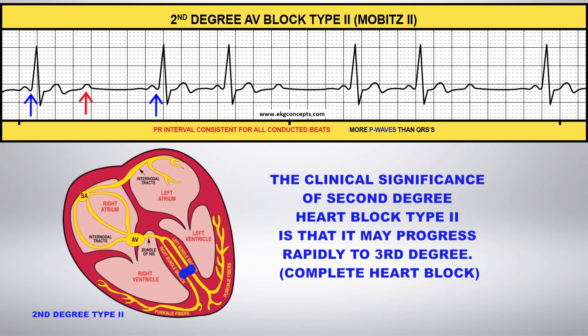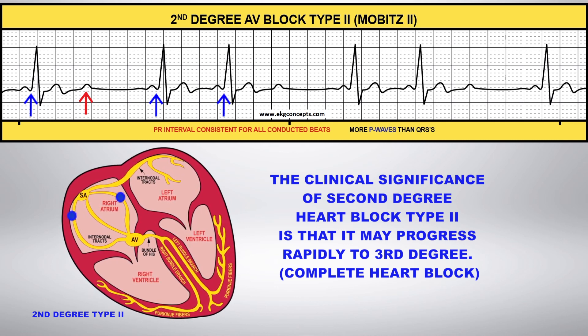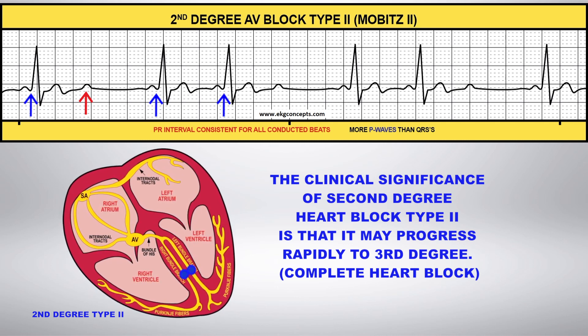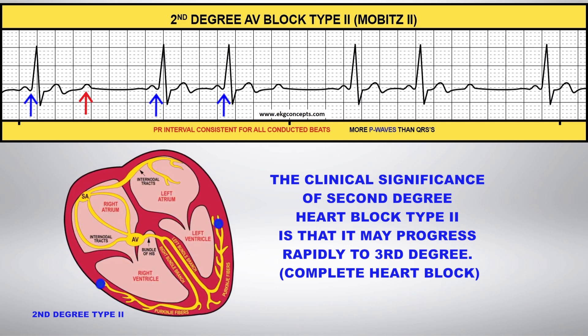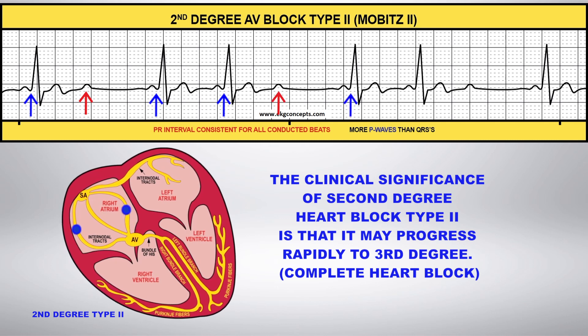In this example, the conducted beats are illustrated by the blue arrows, and the non-conducted beats — or the P-waves without a QRS — are illustrated by the red arrows.